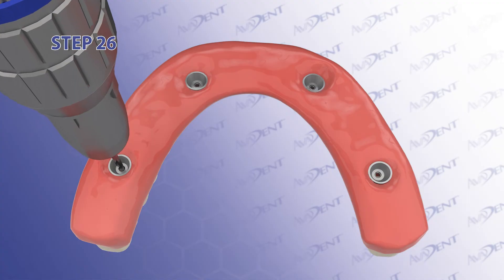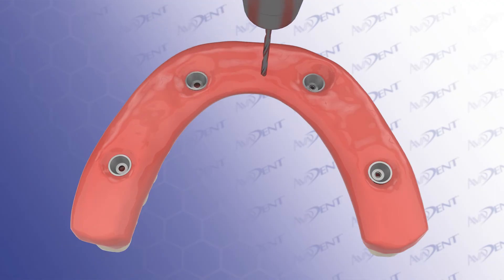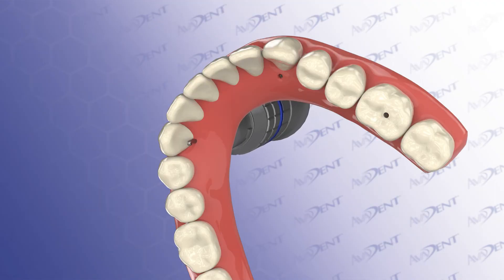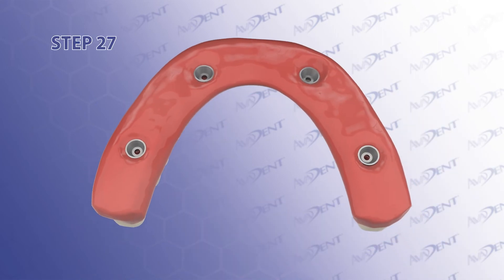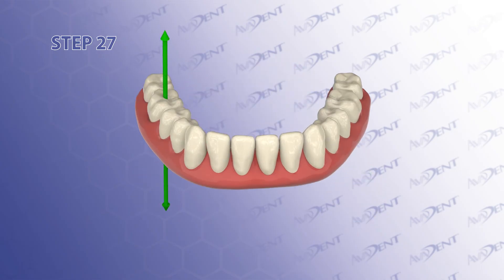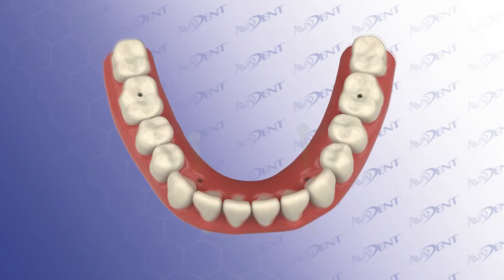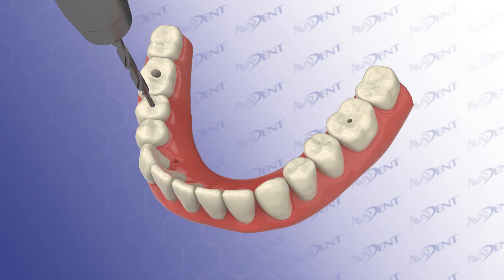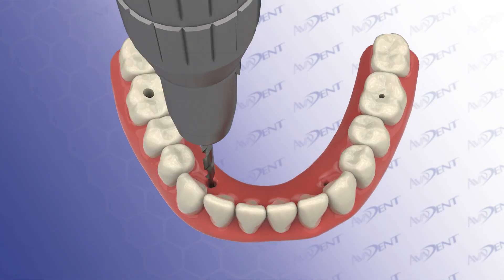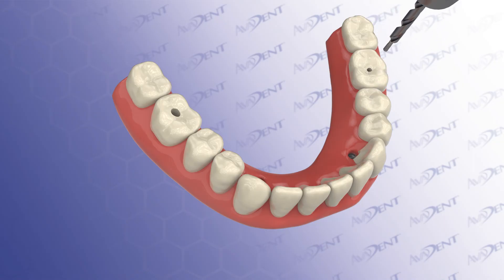Step 26. Create screw channels for the fixed prosthesis in 3 steps. The first step uses a pilot drill through the intaglio of the tie base. To minimize the generation of heat, use a pumping action to clear the drill flutes of debris. Step 27. This initial hole establishes the trajectory of the final screw channel. Be sure to drill in a straight line access to the tie base. Step 28. The second step of the screw channel creation uses a step drill to follow the pilot hole from the occlusal down to bottom out on the top of the tie base. Be sure not to redirect the angulation of the screw channel by using your pointer finger of your non-dominant hand positioned on the tie base to push the denture onto the rotating drill.